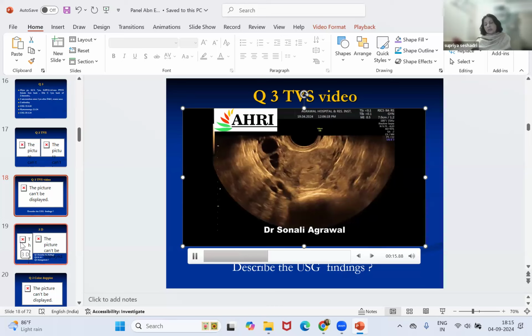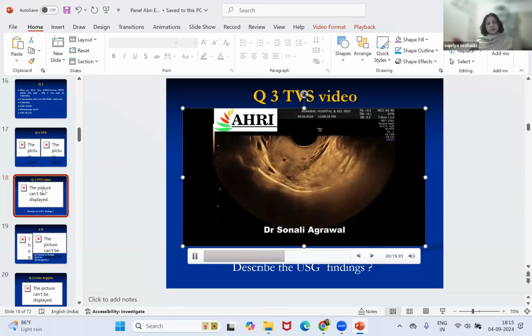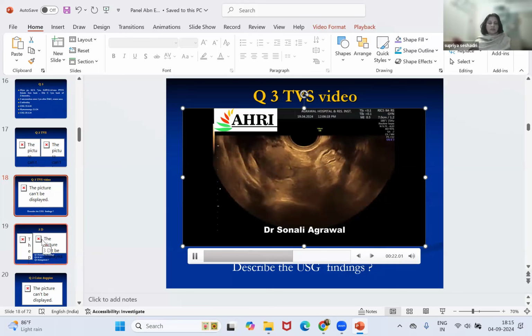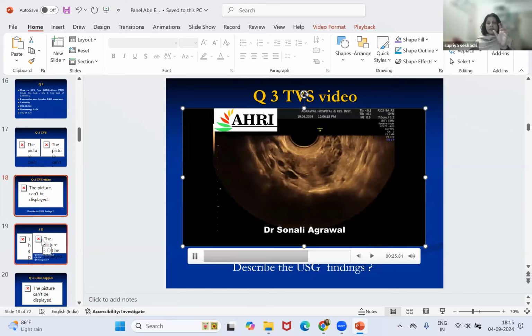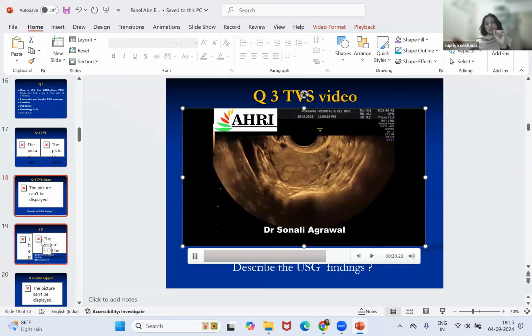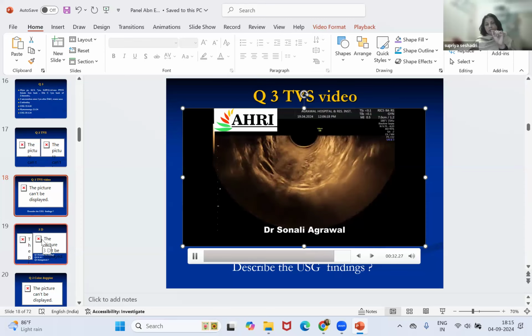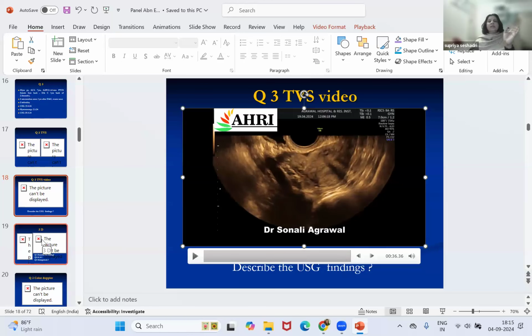In the image, I would magnify only the endometrium, decrease my gain, and increase the contrast a little bit. Then I can see some border. If I can't see a border, I will write endometrium not well defined, hence approximate measurement. It is only one single measurement of the thickest part.